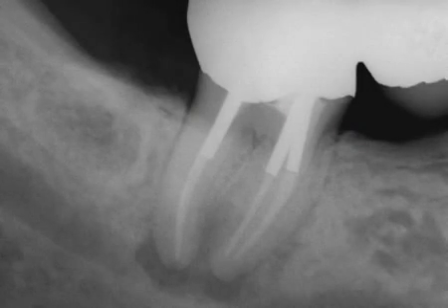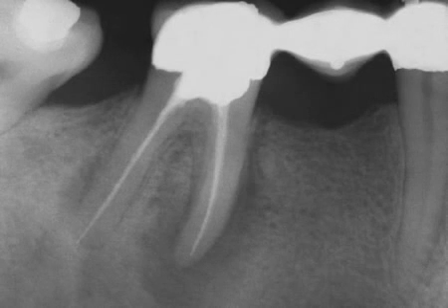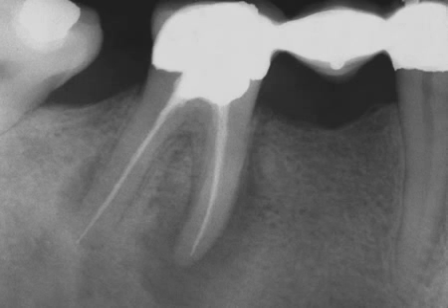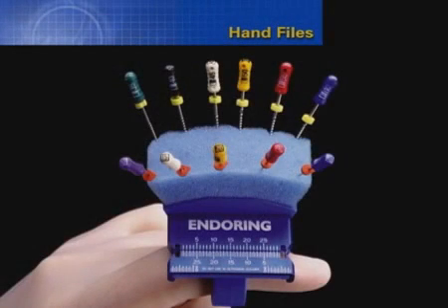Importantly, when radiographically evaluating an endodontically treated tooth, when obturation materials are visualized to end short of length, clinicians should anticipate the terminal extent of the canal may be blocked. In other instances, if any radiographic image reveals that the terminal extent of an obturation material is not centered within a root, then the clinician should anticipate that the canal may be both blocked and ledged. Hand files are essential for the management of blocks and ledges.